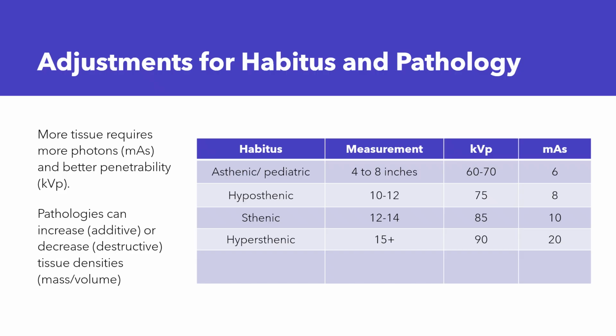Okay. For x-ray purposes, the human body is a solid. Okay. A solid of varying densities or mass per unit volume. So bones have more mass per unit volume than muscles do, than adipose tissue. So different tissue types have different tissue densities. Okay. And so that affects how the radiograph looks. It affects how efficient the kVp is at penetrating. Okay. Bone, because it has increased tissue density, is one of the most difficult things for the x-ray to penetrate.